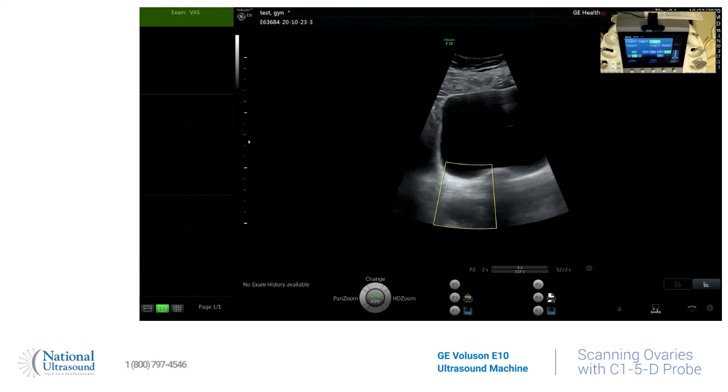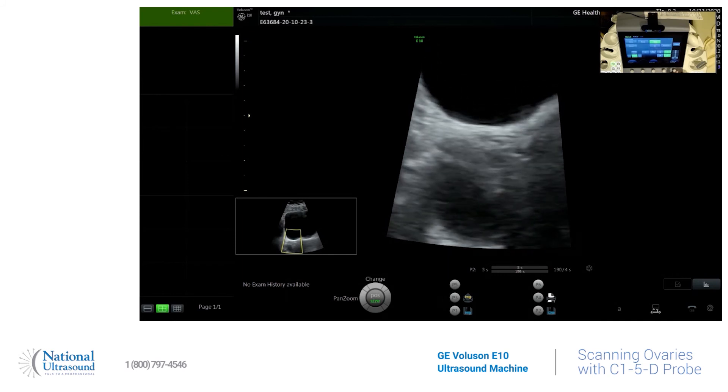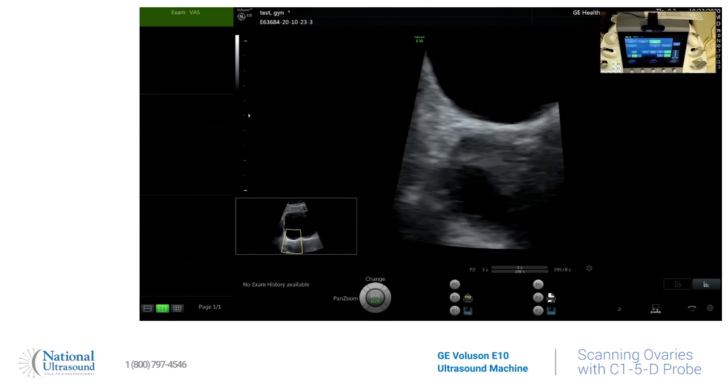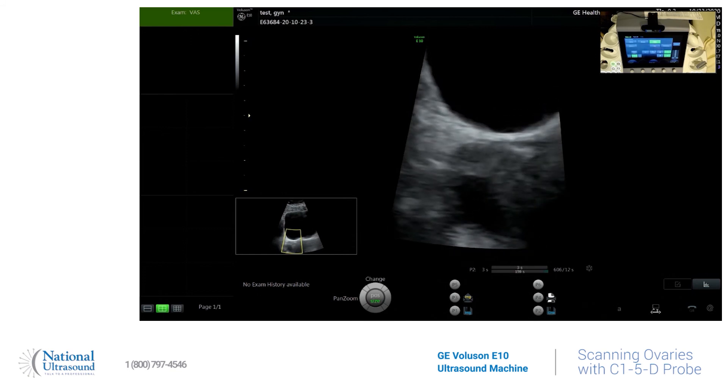You can change the size of your field of focus by selecting change. There is the size — I just like to make it a little bit less pixelated. And then make it dark. You can see my follicle there. There's your ovary using a curvilinear probe, transabdominally, on the GE Voluson E10.